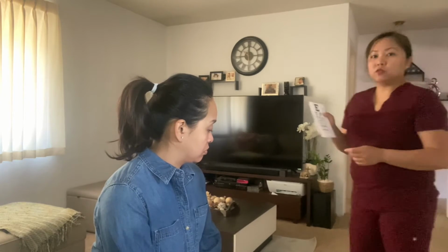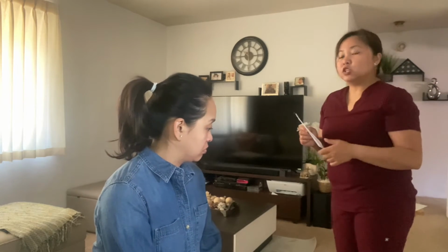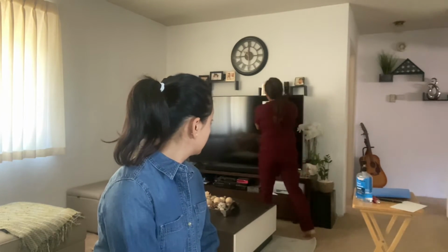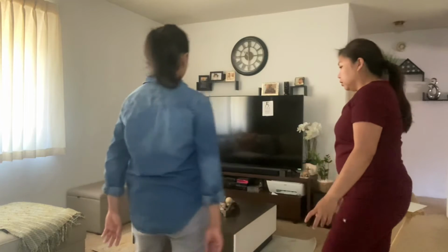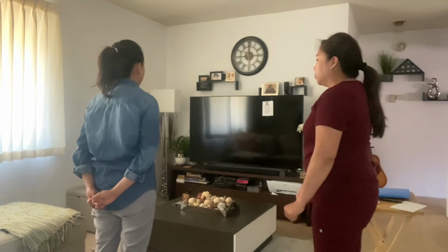So first I would like the patient to stand, and you want to let the patient read the Snellen chart. That way you would see if the patient's eyes have good vision. So you would like to put the Snellen's chart here. And then, ma'am, can you please stand up here about a few feet away from the chart? So usually about 20 feet.